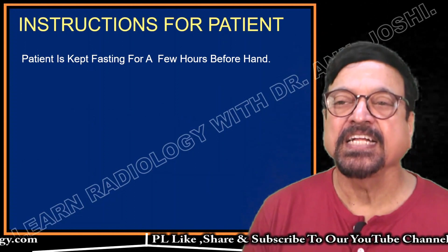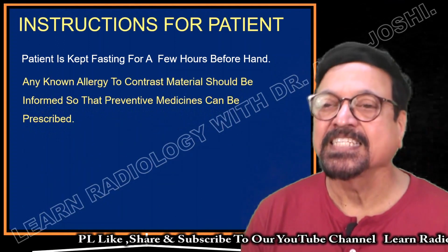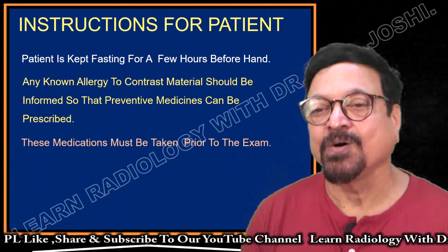Now the instruction to the patient is to keep fasting for a few hours, which is the same instruction as that of the contrast CT scan. Any known allergy should be reported so that precautions can be taken, either prophylactically or after they occur.